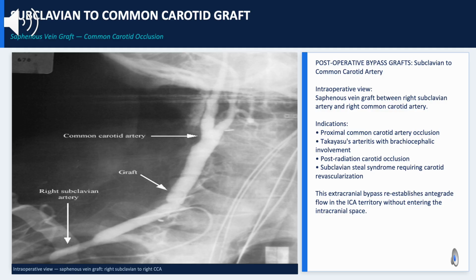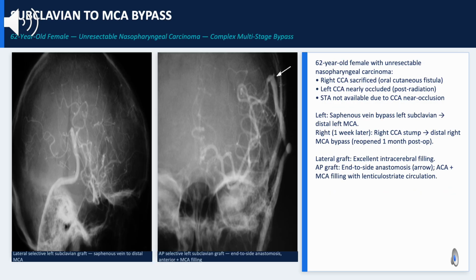Post-procedure follow-up angiography must include the bypass graft as a specific target. Graft stenosis at either anastomosis is common and is the most frequent cause of late graft failure. This case is among the most complex cerebrovascular bypass reconstructions in the surgical literature.